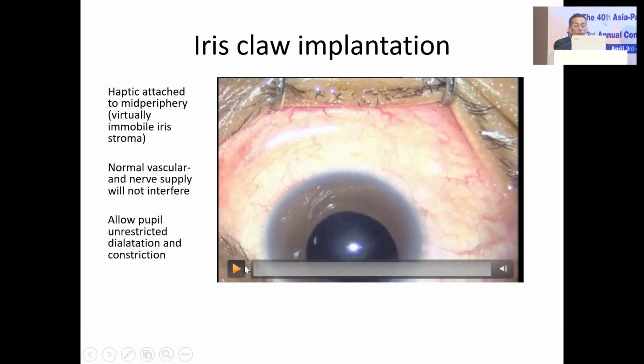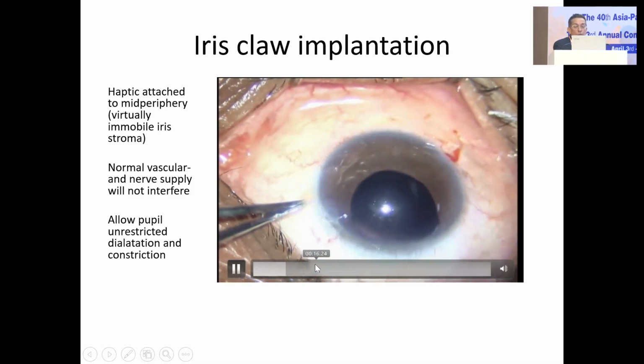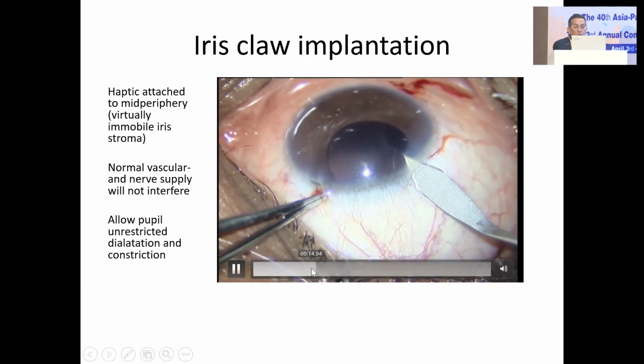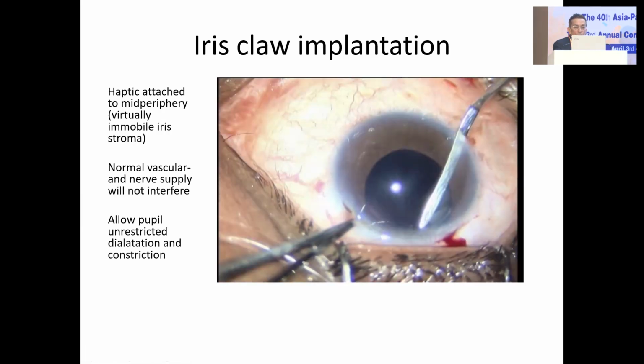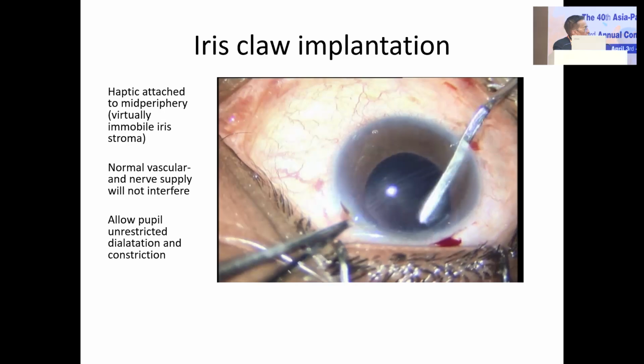I will just fast forward. This is the side port surgery, what we have shown. This is the main port, separating the iris from the wound.